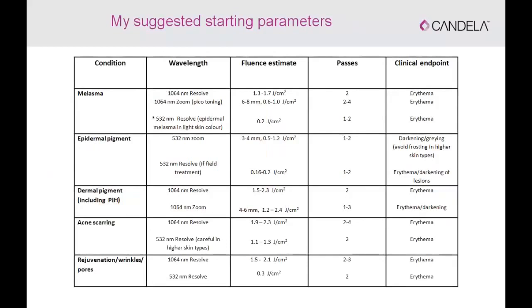For lighter skin type patients with predominantly epidermal melasma, I also use 1 or 2 passes maximum of the 532 Resolve. Again, you have to be careful using that on very dark skin patients. In that case, I limit the use to the 1064 Resolve followed by the 1064 Zoom. We are going to publish our results and experience with melasma using this combination technique, but this is a technique I have found very useful for melasma.